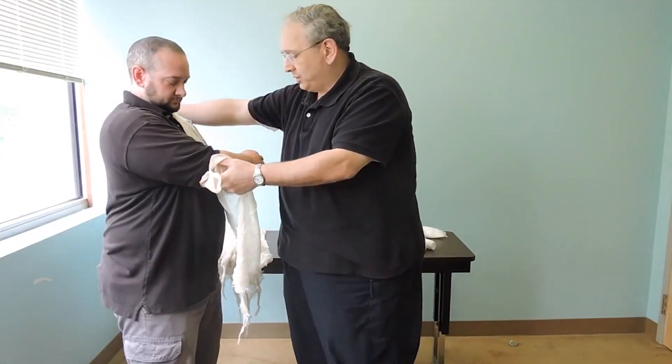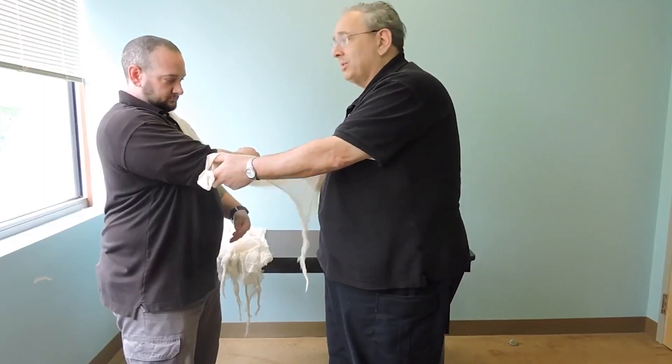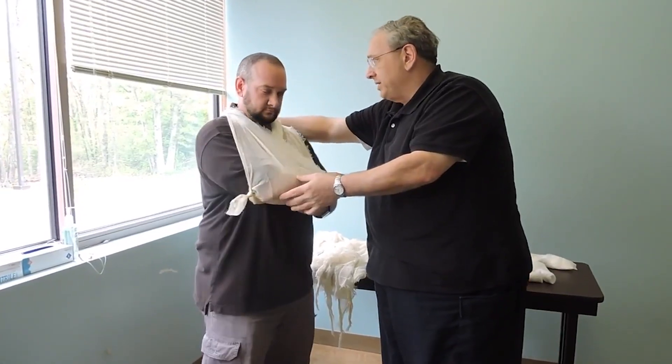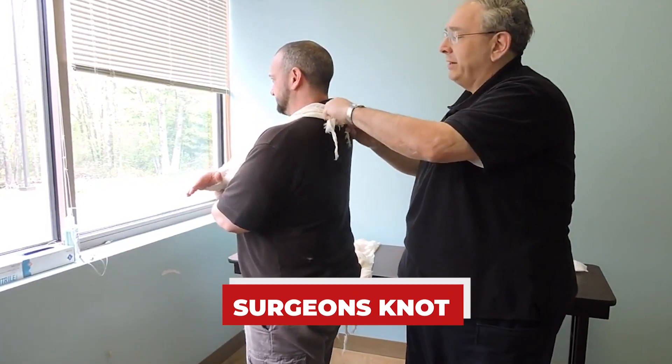I want to take one half of this sling and put it up over the shoulder — over my patient's left shoulder — and the other half bring it up over my patient's right shoulder. As I do this, I'm going to come behind my patient and tie what's called a surgeon's knot.